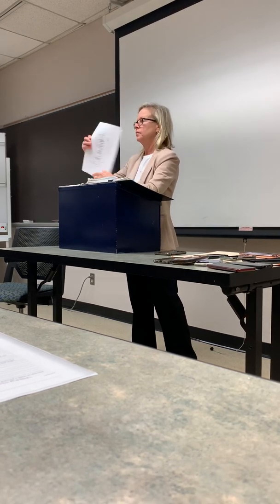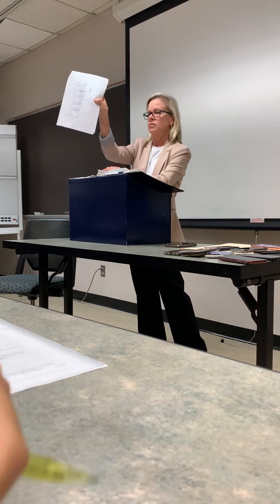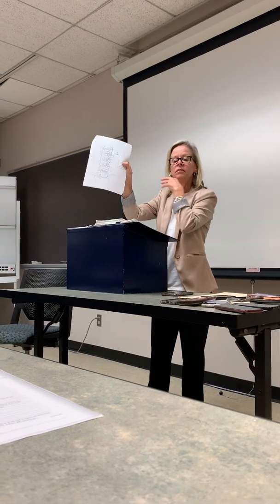Okay, all right. The lumbar Scotty dog. A is going to be the pedicle.